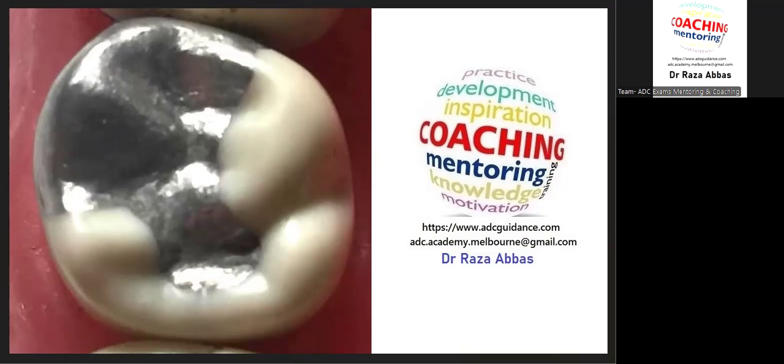Every step is important, because with this task, especially the amalgam task, even if a single step is missed or done wrongly, all will go wrong. That's something that you need to be very careful about. That's why we have such detailed demo and assessment videos, which are quite lengthy, because we don't want you to mess up even a single step, because every step adds to your final success and for the restoration.